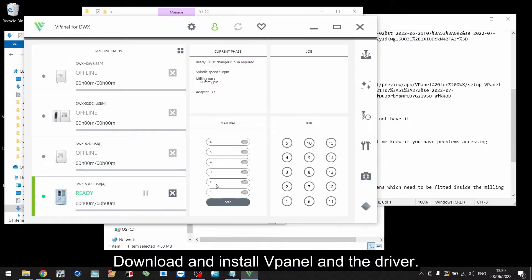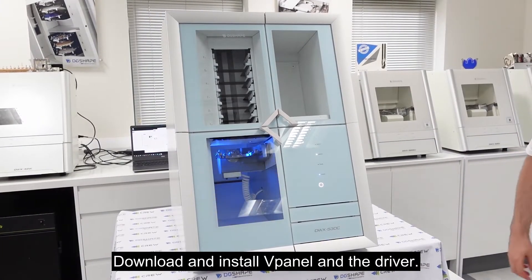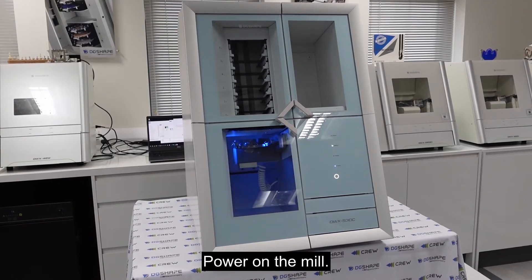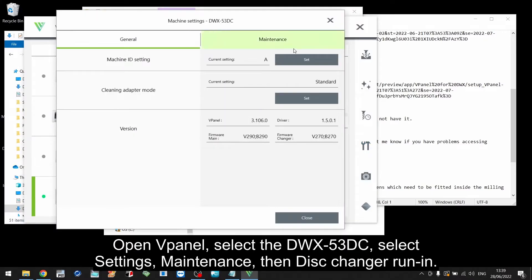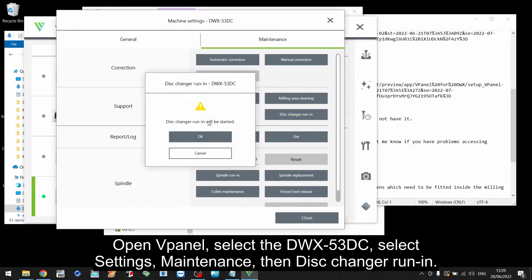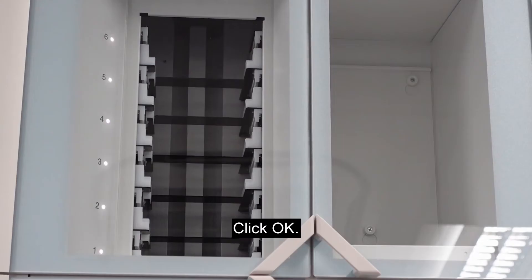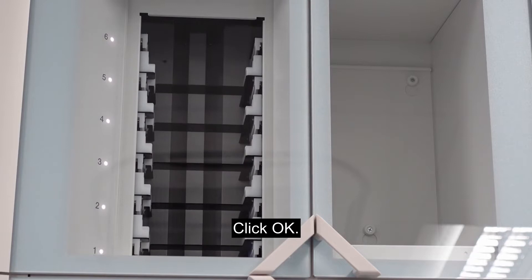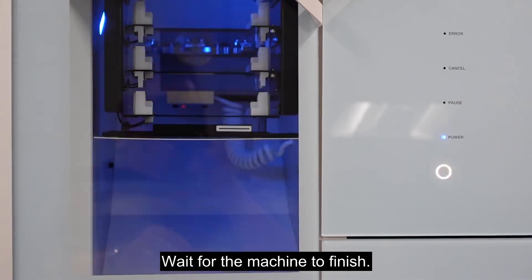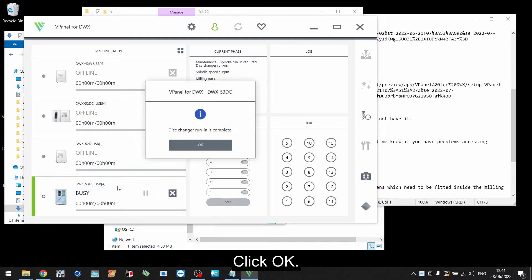Download and install V-Panel and the driver. Open V-Panel and select the DWX-53DC. Select Settings, then Maintenance, then Disk Change and Run-In. Click OK and wait for the machine to finish, then click OK.